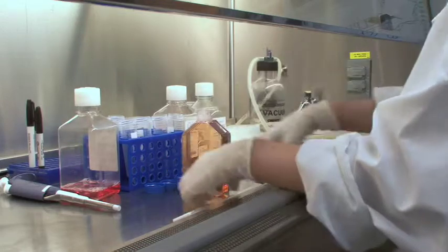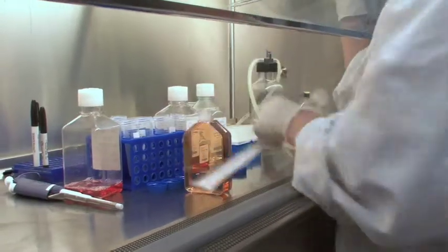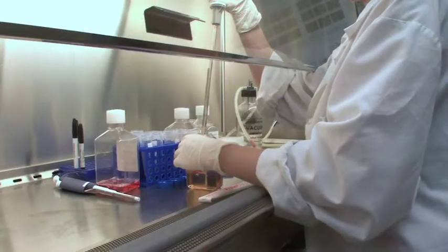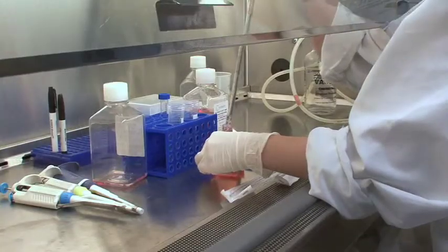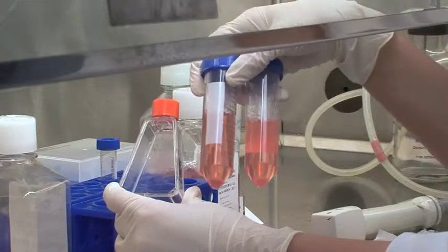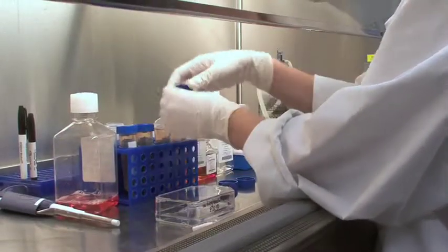Transfer into tissue culture hood. Remove 100% media and transfer into 6 50 milliliter sterile conical tubes. Set aside for further processing. Note, in the T25 version of the protocol, there will be 2 50 milliliter conical tubes as opposed to the 6 for the T75 version.